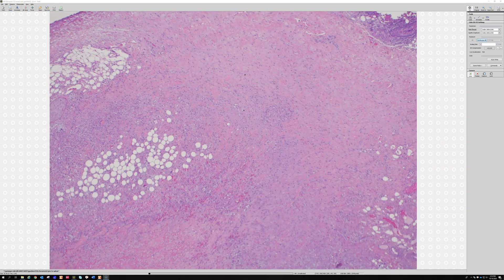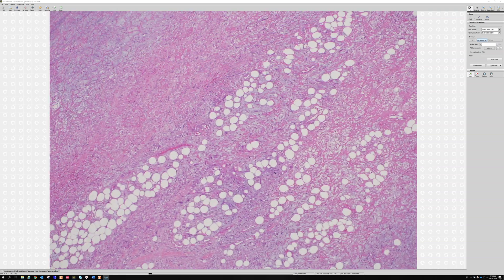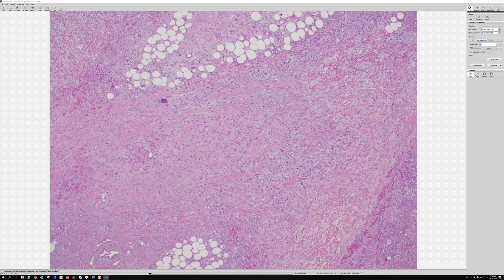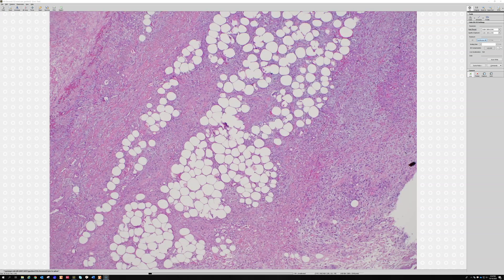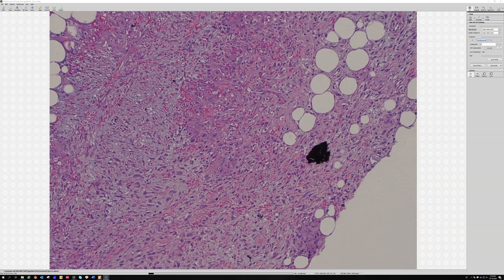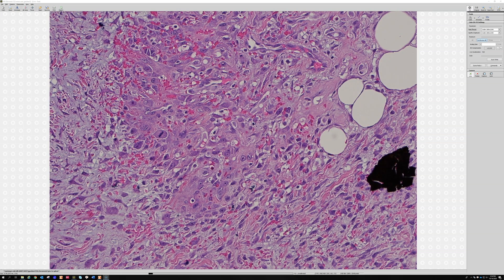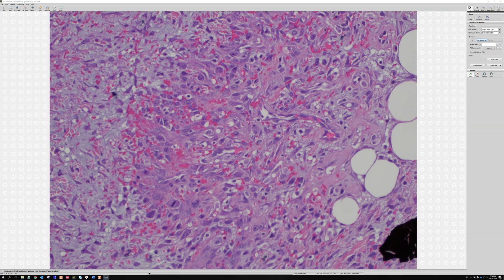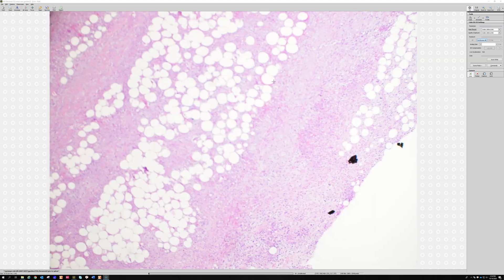Ischemic fasciitis — recognizing the loose myxoid fasciitis-like stuff in the background really helps, in addition to the zonal pattern. Here's another area that's really scary looking: really revved-up vessels, and there's even a mitosis. If you just took a high-power picture of that, anyone would be terrified and think it's bad. But when you put these reactive vessels and myofibroblasts in the context of the background that all looks like fasciitis, it's totally fine.